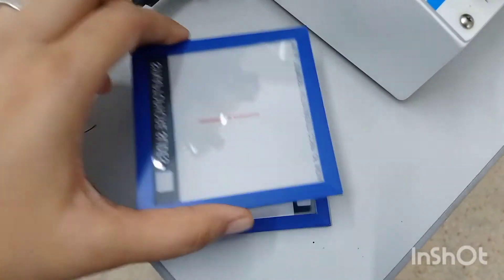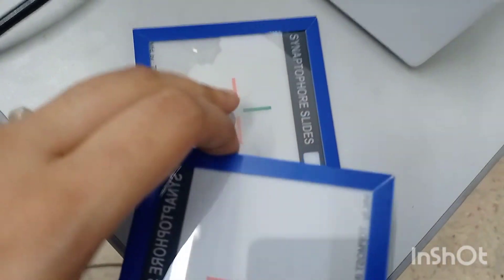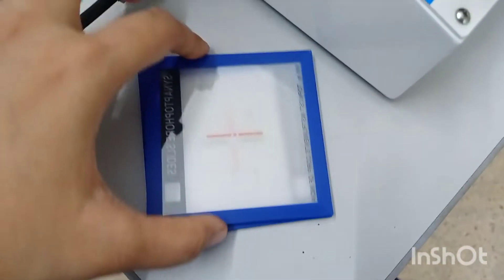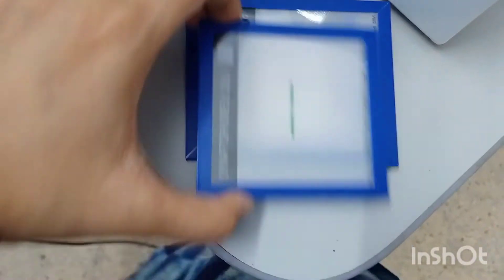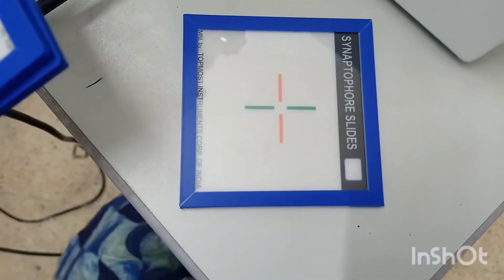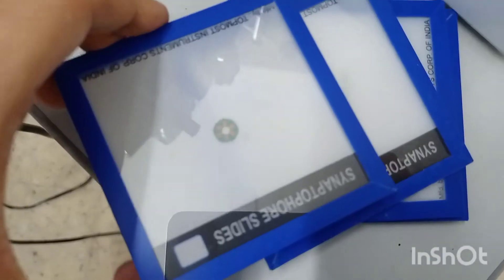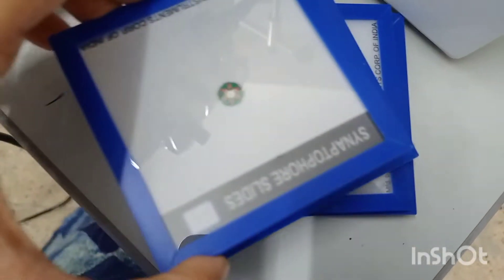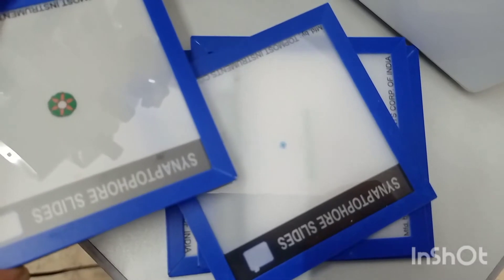Now coming to the after image test. The after image test is used to determine ARC. You can see one red line — one vertical and one horizontal separate line. We show that in front of the patient and the patient has to report. If the patient can see a perfect cross after seeing that image, after removing his eyes onto a white screen or wall, that is the result.